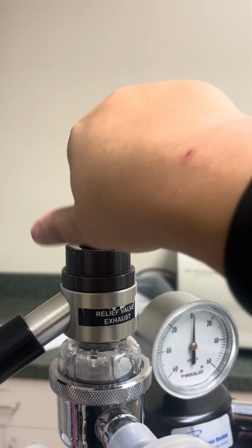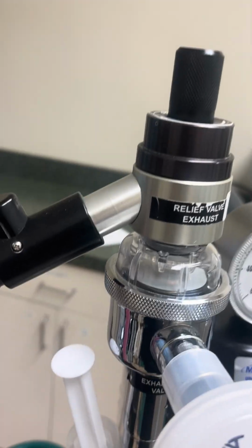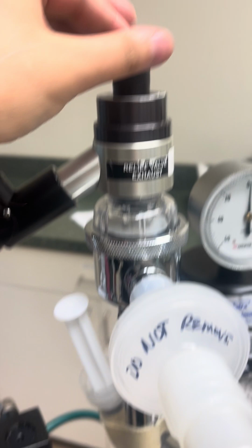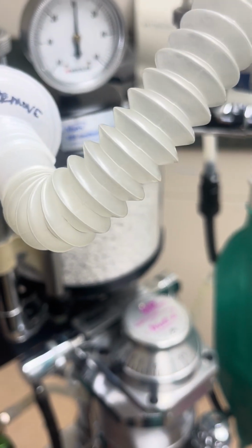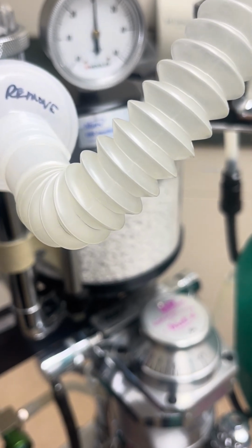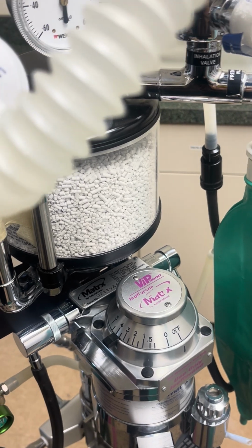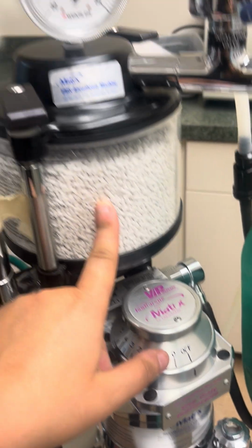Our next piece is the pop-off valve itself. I showed you in a previous video how to turn it off and on for a pressure check, but we always keep it on no matter what. The only time you turn it off is during a pressure check. And another button you can press for a pressure check is this. It's just a quick pop-off valve, but this one I feel like is more reliable. All right, and it allows gas out of the breathing circuit and directs it towards the scavenger outside the system, or recirculated to be reused via the CO2 canister.